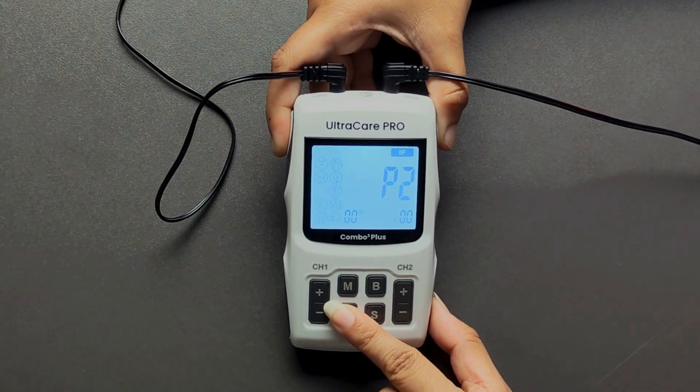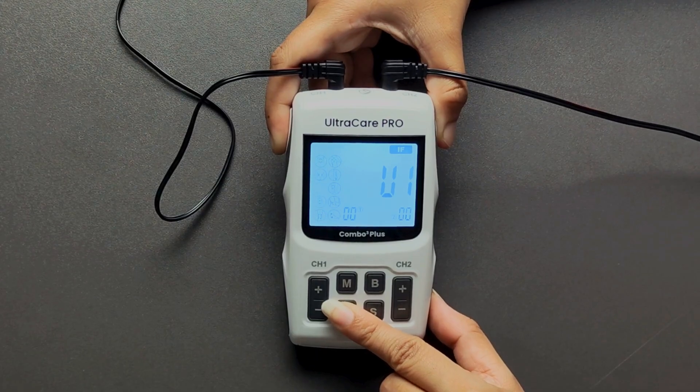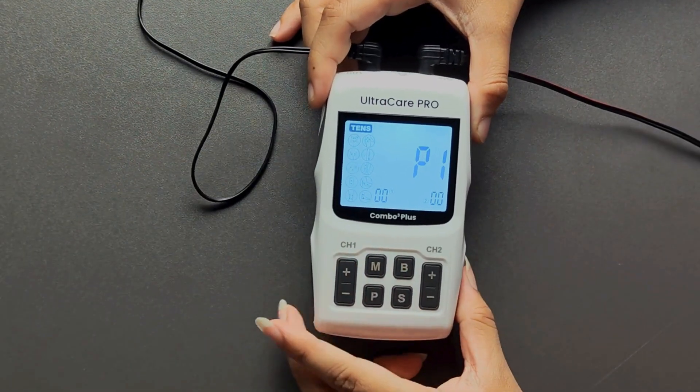P1 is for acute pain, P2 is for chronic pain. U1 is a manual mode and should only be used under professional guidance.